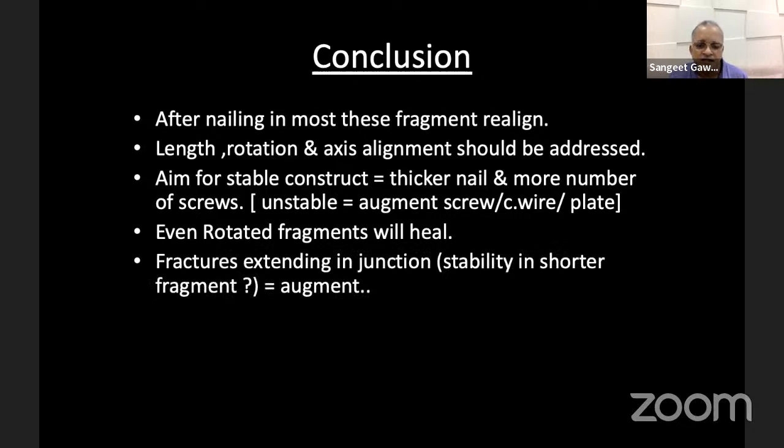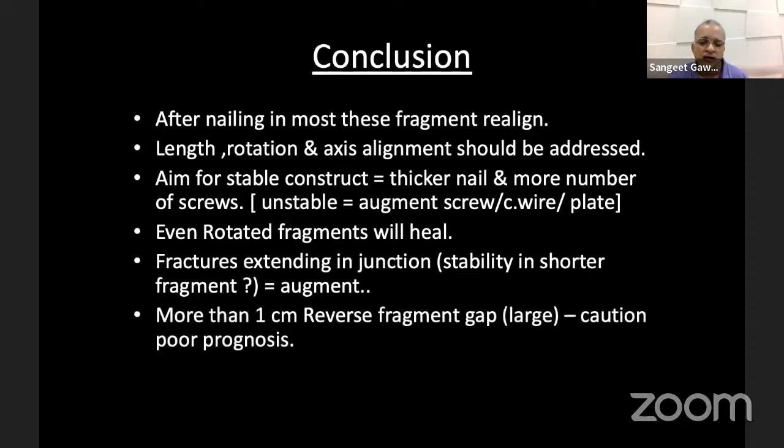Fractures extending into the junction, where stability in the shorter fragment is doubtful, always augment these junctional fractures with an additional plate. More than a centimeter separation of the reverse fragment from the nail has a poor prognosis, and these are the ones which you have to observe serially when they come for follow-up. Thank you very much.